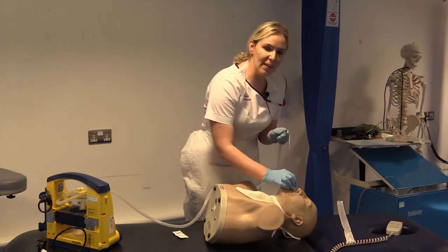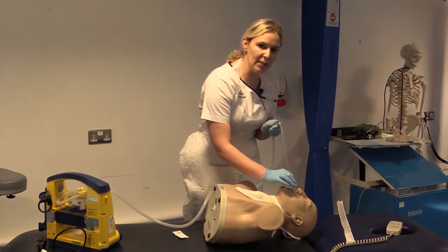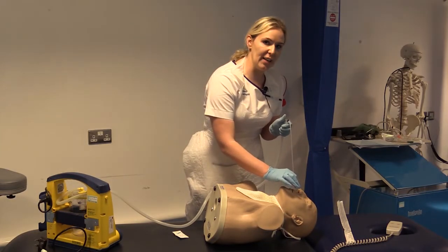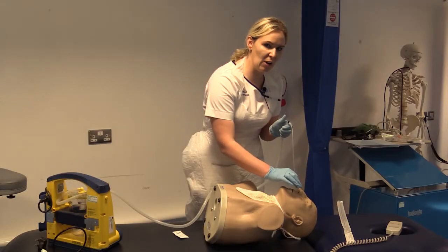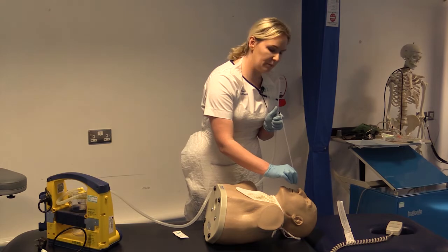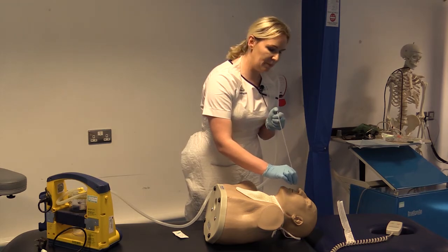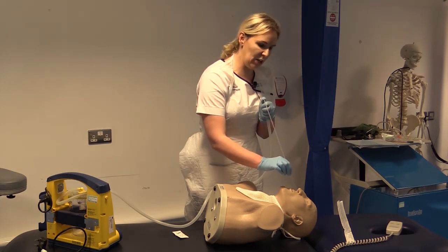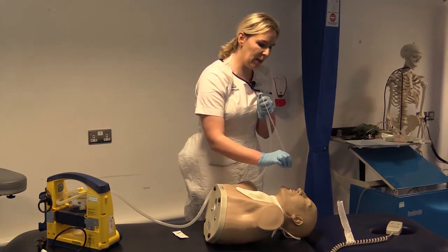Okay. If you feel you're getting stuck, you're going to come out ever so slightly and you're going to gently reinsert. Okay. So what you're looking for is the cough. If you're not getting a cough, you'll feel resistance. You come off about 1 centimetre. You apply your suction, and you slowly remove, okay? And once you decide to come out, you shouldn't be going back in and out. Okay, and out you come.